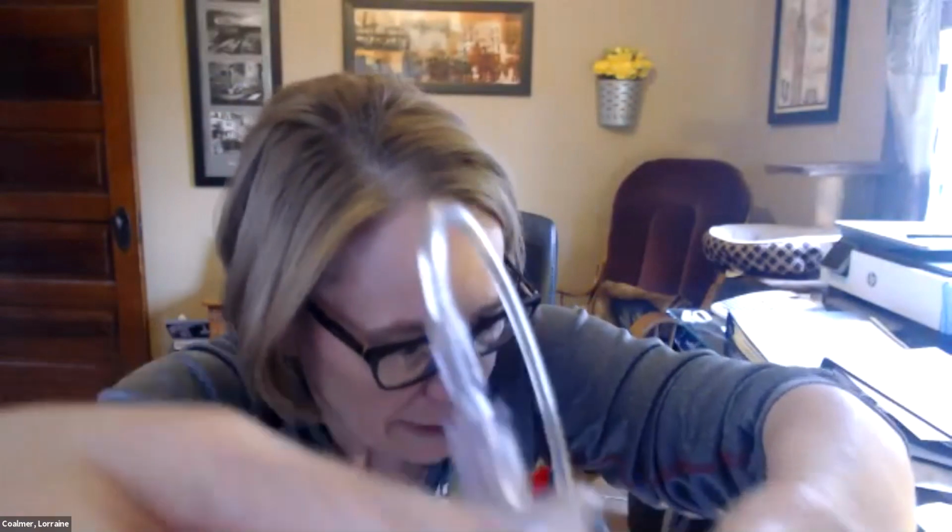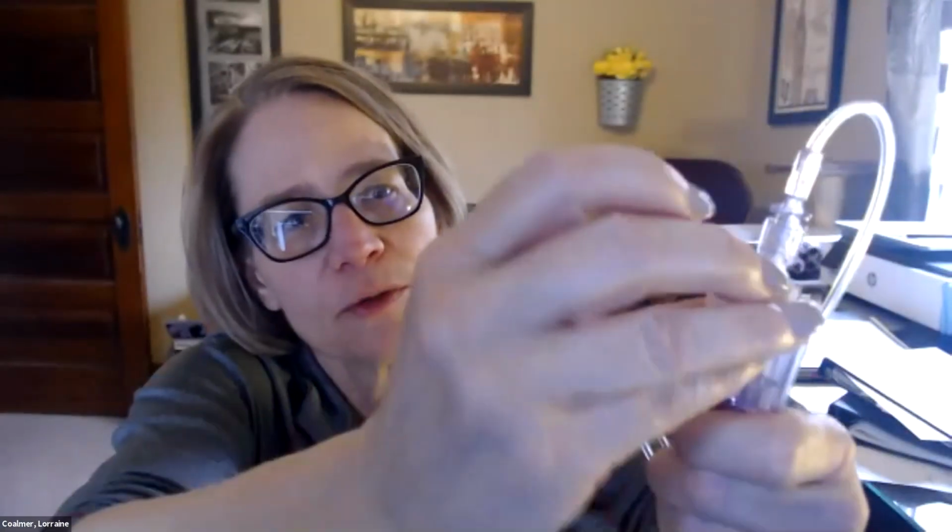This right here, we take this off and we put on a blue cap. I don't have any here, but we put on a blue cap and we level to this port right here. We level to that port. I don't know if you guys can see that.